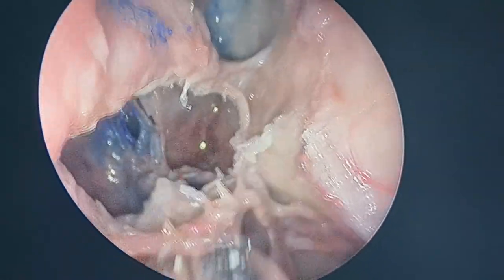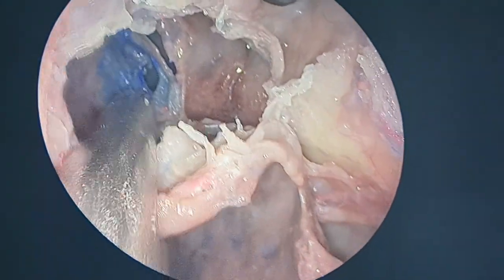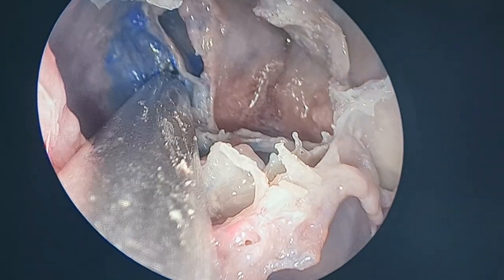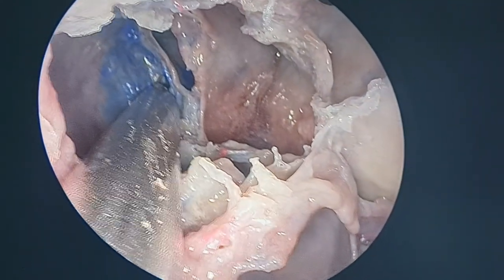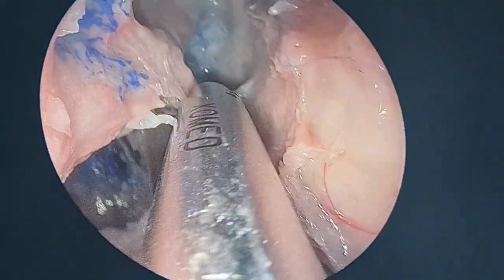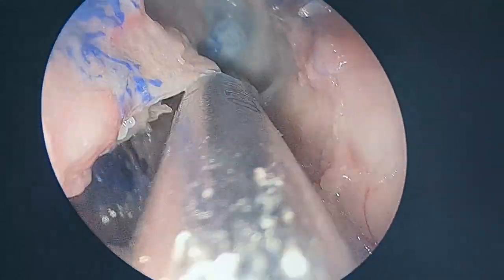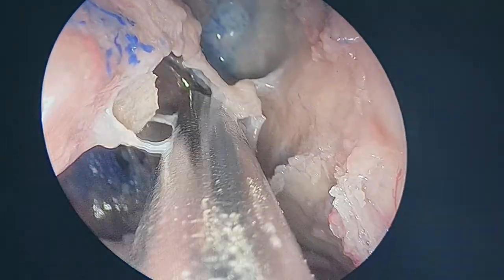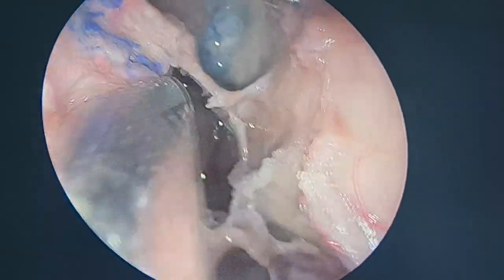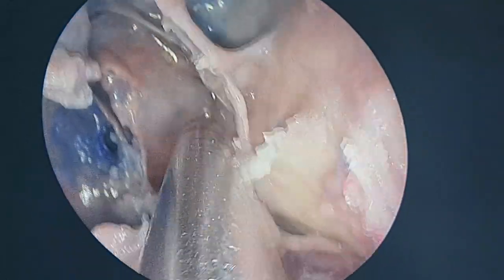The corridor is limited laterally by the orbit, medially by the septum, posteriorly by the sphenoid ostium. We are not supposed to transgress this limit posteriorly, otherwise you can end up injuring critical structures. And now you can dissect. See now, my posterior ethmoidectomy is done in no time, and that too with 100% safety, that I am not going to damage, even if there is an Onodi cell or no Onodi cell, any critical structure behind. See, this is how the posterior ethmoidectomy is created.